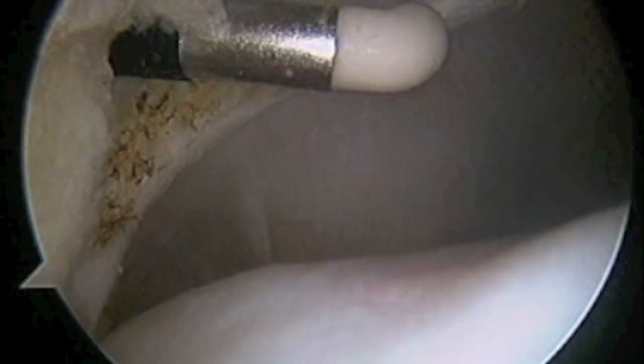Here you'll see a before shot with the plica interposed, and then an after shot once we've excised that plica.